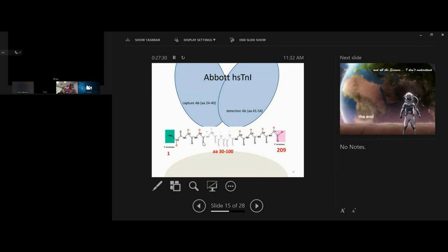Now, I'll admit that part of the story might just be that a lot of macrotroponins we're picking up on high sensitivity assays are way down at those low levels where the point-of-care assays are a bit dodgy anyway. But certainly at higher level troponin results, say over 100, that's nanograms per litre on your lab analyzer, or 0.1 in iStat units, if you want to exclude a macrotroponin, the iStat might give you the answer. The iStat might just be the one that's right when the lab analyzer is wrong.